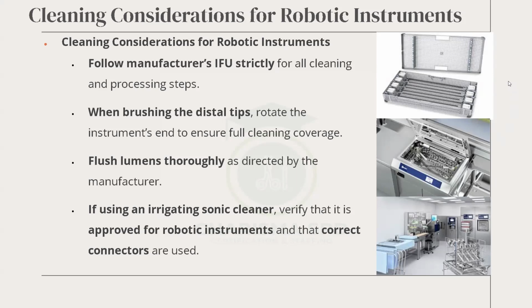Again, you connect it, the IFU will show you, and you get in-service on it. Most of the robotic arms most of the time are done by the robotic sonic machine. But because it's a machine, it will break down. And when it breaks down, surgeries must continue. They are not going to hold surgeries. They are not going to cancel cases. Surgery will continue. So you have to do it using the improvised way, the alternative stated by the IFU.